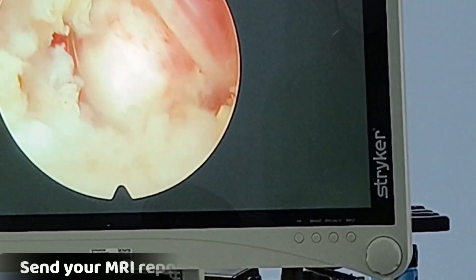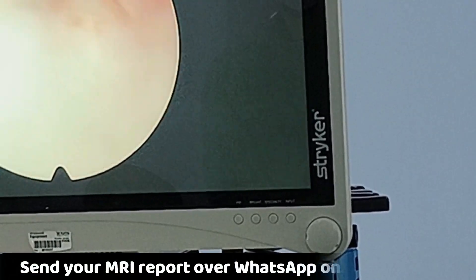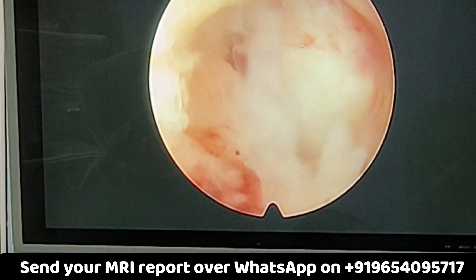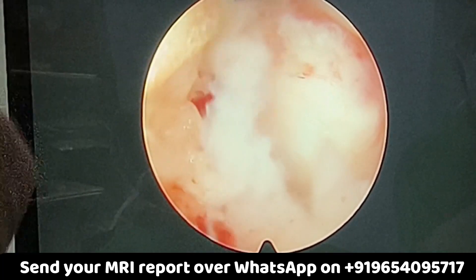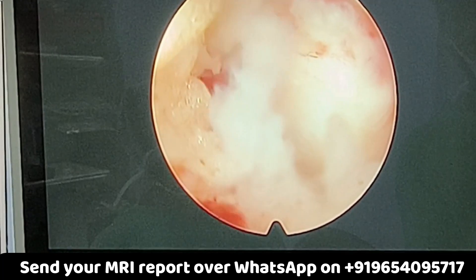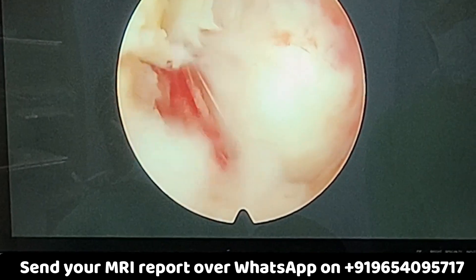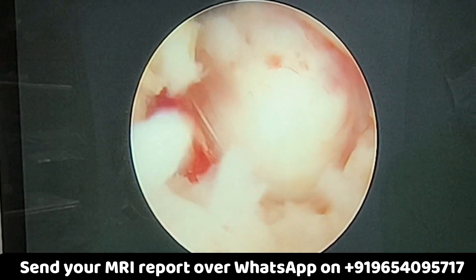For removing the disc we have a special instrument which is used to make holes in the annulus part of the disc — that is the outer covering of the disc. First we make those holes so that we can remove the part of the disc that is causing pressure over the nerve root.